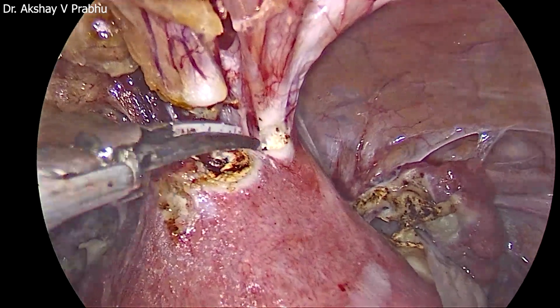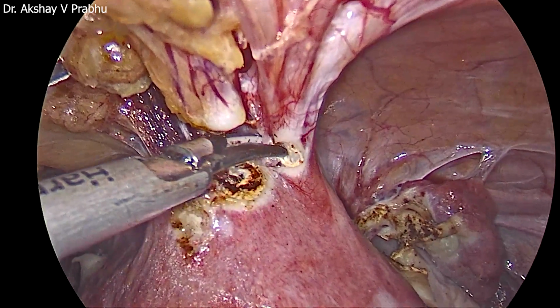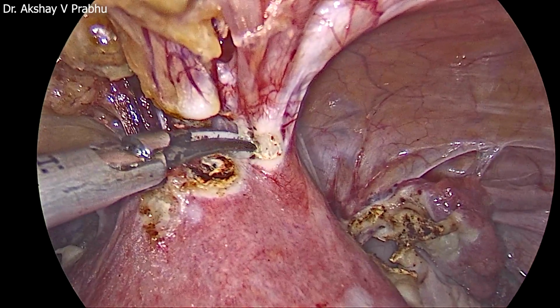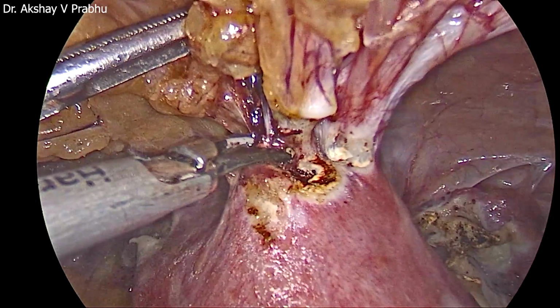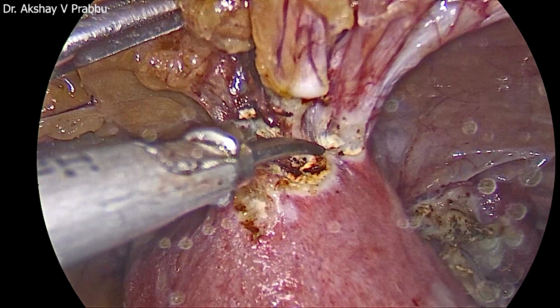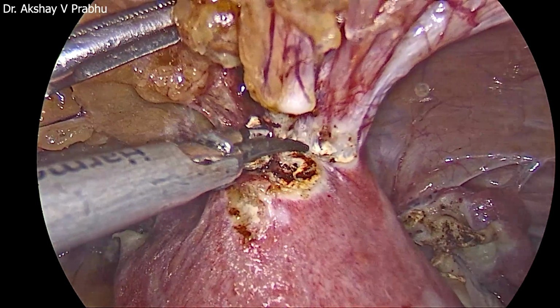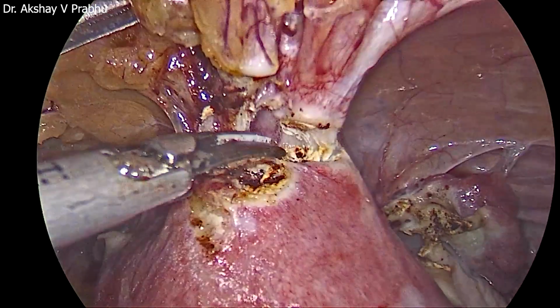If you can see, the adhesion tissue or the band is giving way. The hope is to find a good virgin plane by going millimeter by millimeter, because the bladder also comes and gets adherent to the same side. But at the look of it, we can see that there is no bladder there. I'm staying closer to the uterus to be cautious. If there is excessive bleeding, then you can understand that you have gone into the uterus, because that is where the vascularity is going to be.